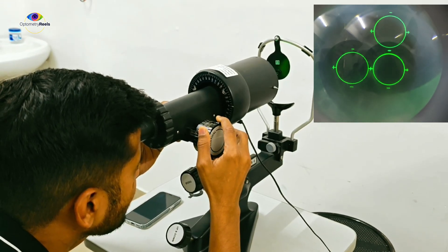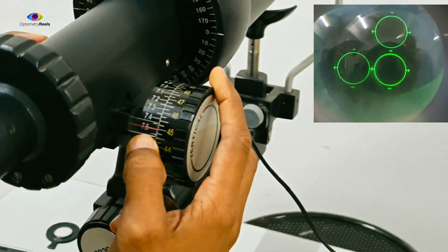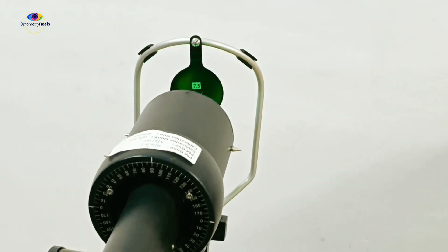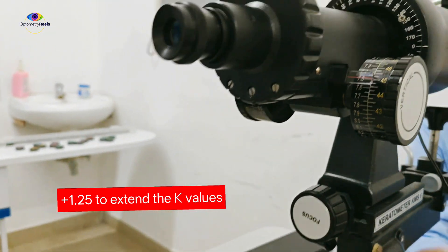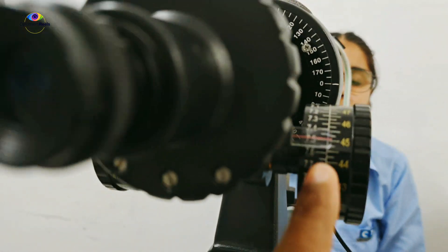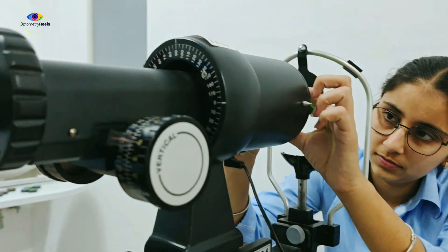This is the mire of 7.5 mm. As we can see, the reading is 7.5 on the scale, which is 45 diopters, matching the dummy cornea. Now I am going to use the +1.25 diopter lens to extend the keratometric values. You have already seen the mires — 7.5 mm was 45 diopters for K1 and K2. We are going to place this lens in front of the objective and see how much we can extend the reading of the same 7.5 mm cornea.